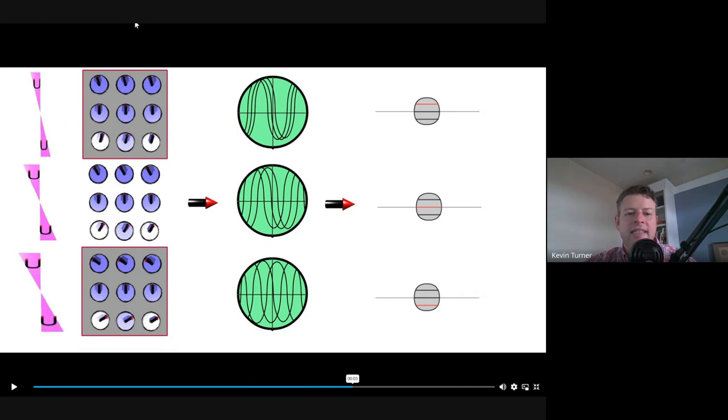Once again, this is the idea of encoding. The gradient turns on, changes phase. That change in phase, remember, we're talking about why the phase changes based on where the patient is. If we're doing a head and the patient's at isocenter, then the gradient's making these protons faster and these ones slower. That change in phase creates a different looking echo, which the computer can read and then say, okay, cool.